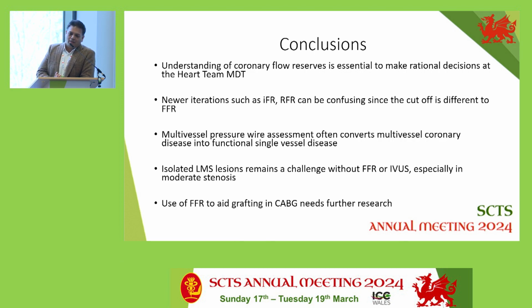That is important to realize in an MDT setting. Isolated left main stem lesions do remain a challenge, and especially moderate lesions, although the recommendations would suggest bypass, are often pressure wire negative, as shown in the studies. And finally, use of FFR to aid grafting in CABG needs further research. Thank you.